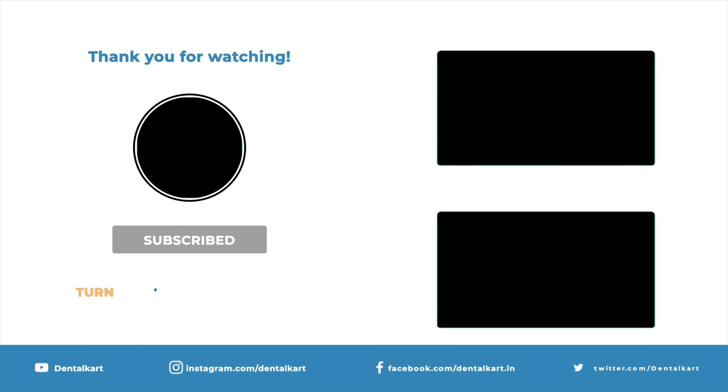Mandibular molar forceps are used to extract the first, second, and third molars on both sides of the dental arch. The beaks are positioned at a right angle to the handle and feature pointed hooks on both sides, allowing them to fit snugly into the buccal and lingual bifurcation areas.